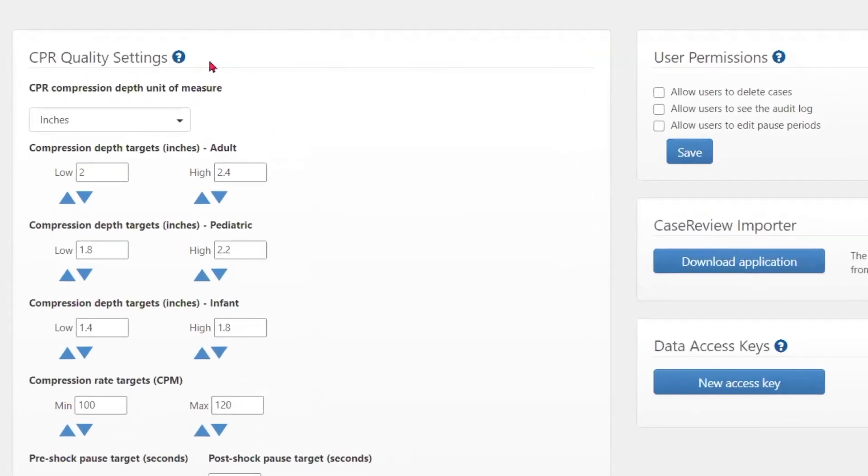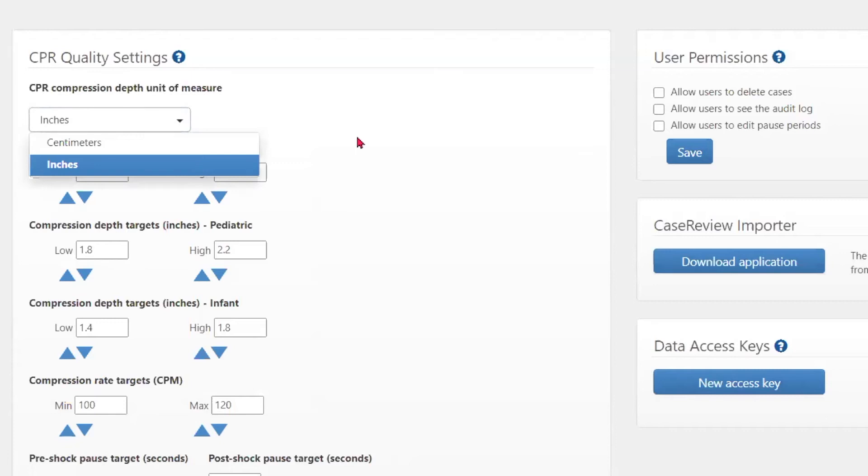The CPR quality settings allows users with access to set and change the targets that are measured in the performance of CPR. The units of measure can be selected from the drop-down menu to reflect measurement in either centimeters or inches.